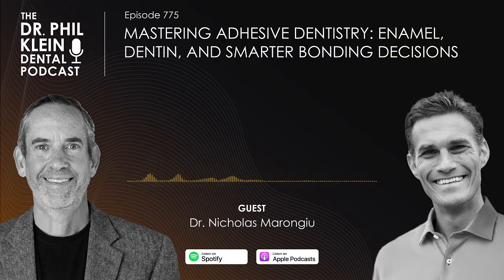But the low pH, the acidity, can also interfere and inhibit the chemical curing reaction of dual cure and self-cure resin cements. So how do you handle that? So even with the dual cure, we're still using the light cure on top of it. The curing is a very important aspect. Undercured resins, one of the fastest ways to a failure is to have undercured anything, whether it's adhesives or resins, composites, any of it. I don't ever rely purely on the dual cure. I still light cure on top of the dual cure.